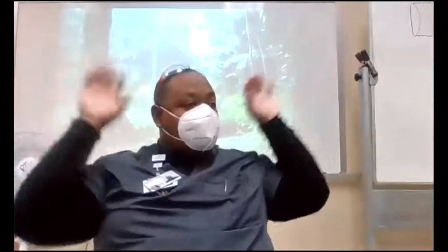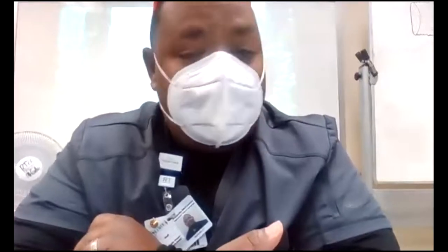Now, the last part before break, the general considerations to remember. 44 milligrams per liter of water is what the target volume is. Why is that the target volume? Because that's what the body does. We're trying to match the body. We ain't trying to do no more, no less. So 44 milligrams per liter of water is the target volume. That's how much volume of water we're trying to deliver, because the body does that.